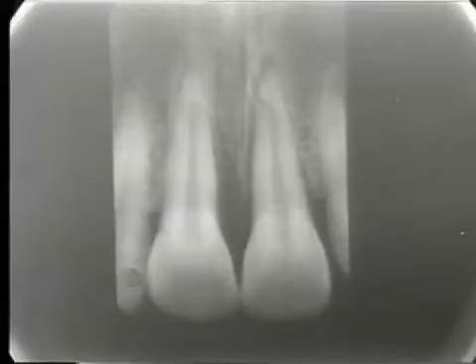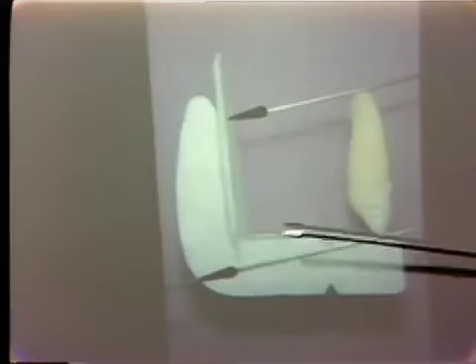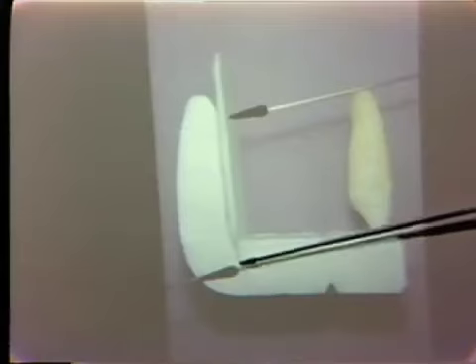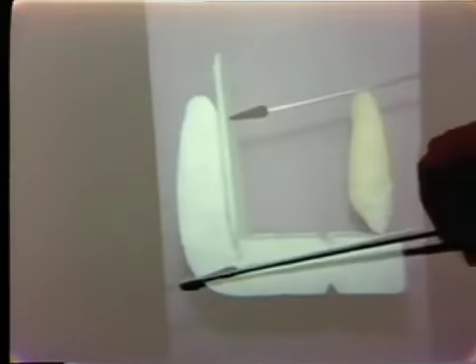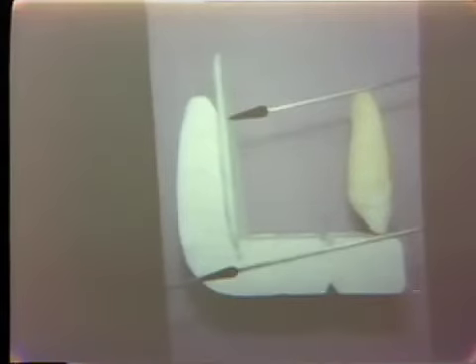Now sometimes we get a bit careless in choosing the vertical angulation, and instead of directing the rays truly in the direction indicated by the block, we may direct the rays downward in this manner. And so the image of the incisal edge is cast below the film and never does record on the film. There'd be no black border.